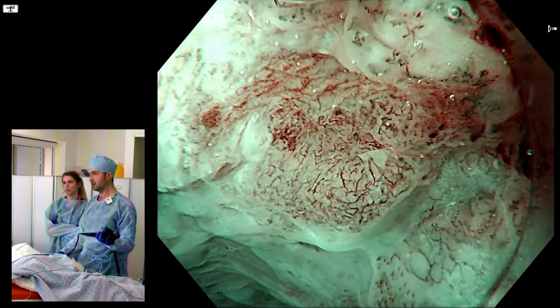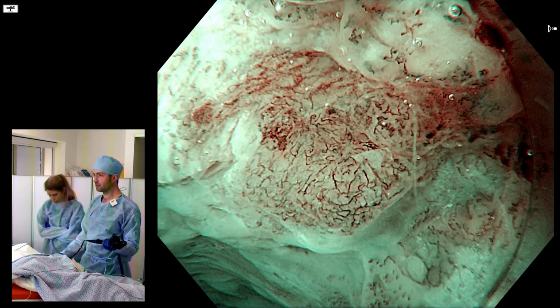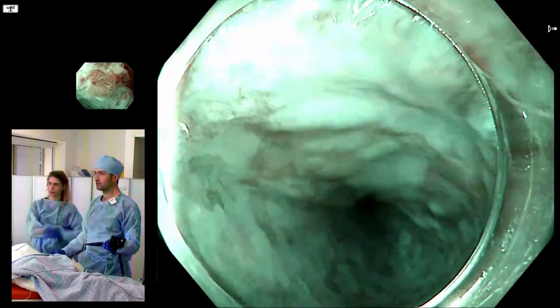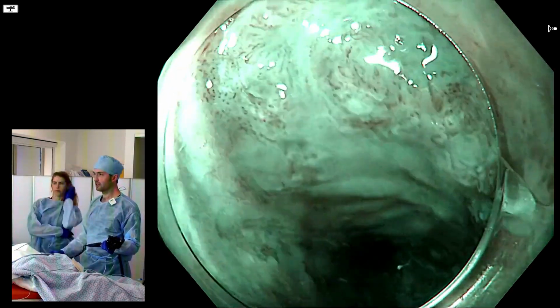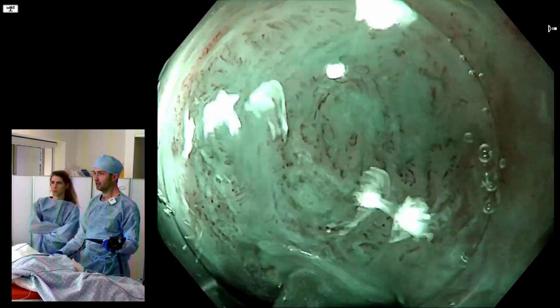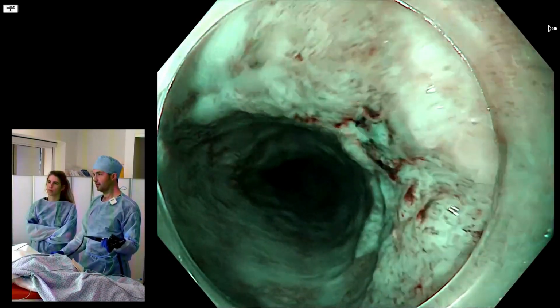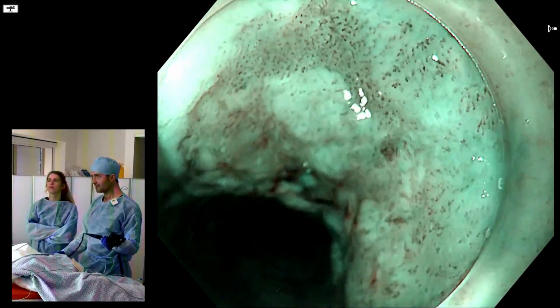Here you go, you can get this great image of the microstructure, and you're looking for the part of the structure which is the most disordered, right? So we're not just going to take a photo up here and be like, okay, well that's not useful. The most useful part to make the decision is the part which is the most disordered.